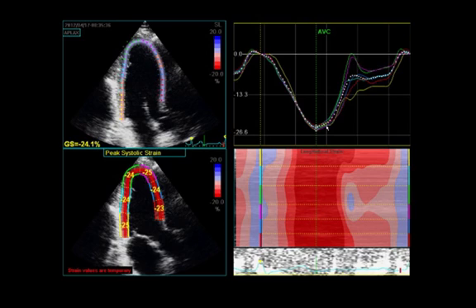Yeah, that's funny you say that, Daniela, because I personally feel like, maybe I'm just too compulsive or nerdy about imaging, but to me it helps because it sort of takes the subjectivity. Even when I do very compulsive volumetric measuring and tracing of the ventricle, when I get an EF, I don't feel 100% precise.